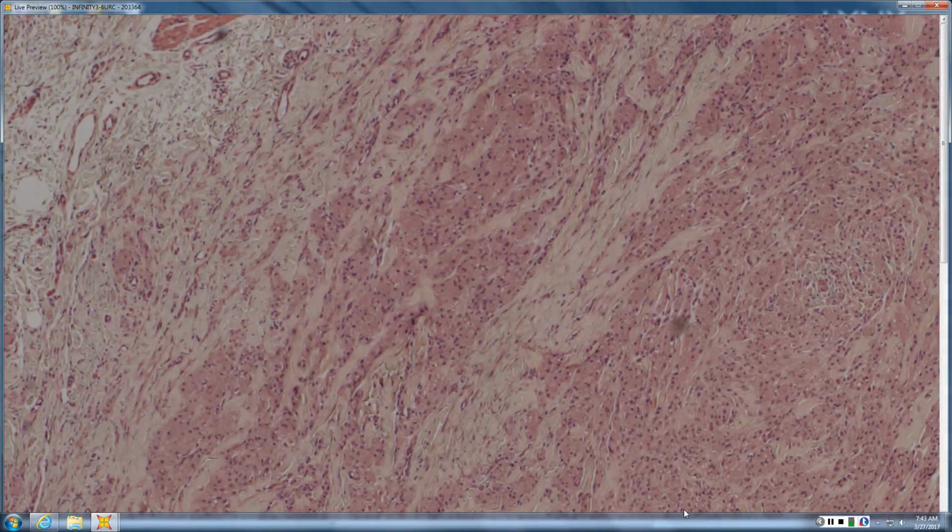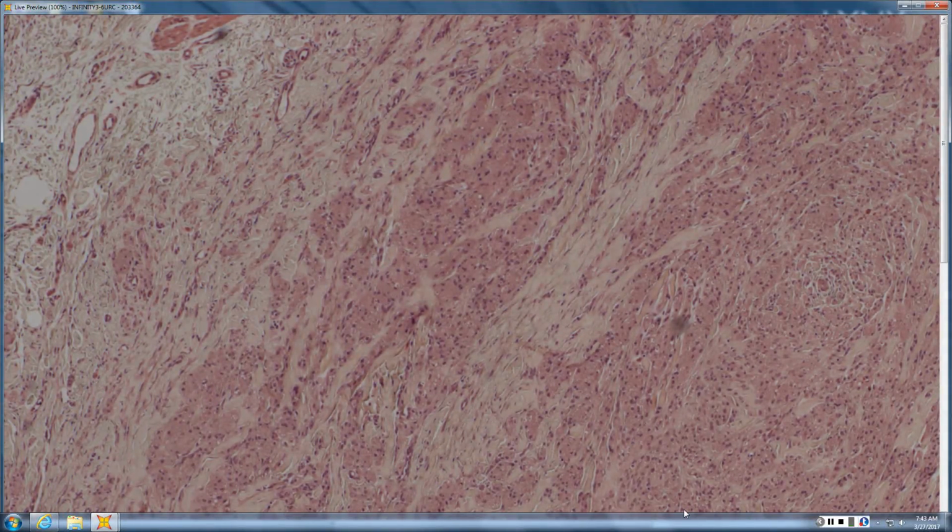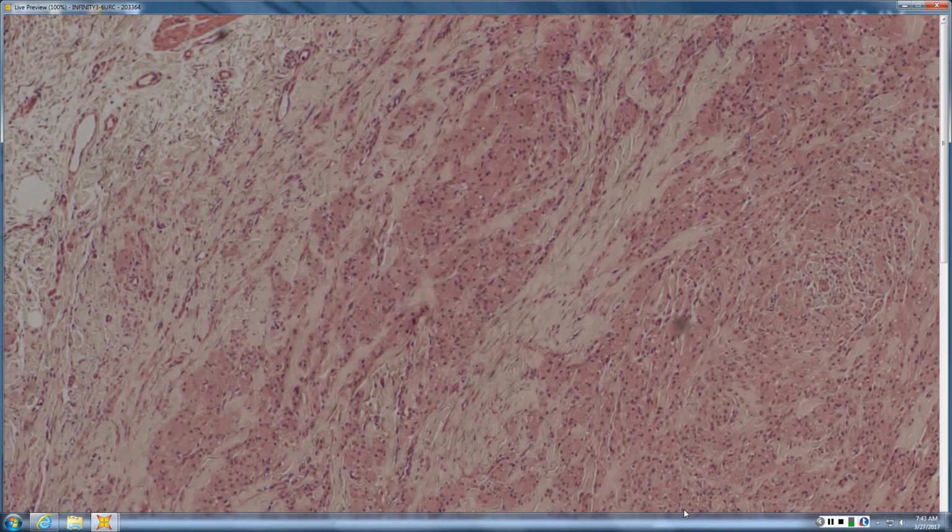So neurothekioma certainly goes in nested theques. They're usually clear because of all the mucin. This thing is pretty pink. So it's pretty pink, and even at scan, you can see these things that are giant lysosomes sitting in a vacuole. Is this just granular something? So this is a GCT, granular cell tumor.